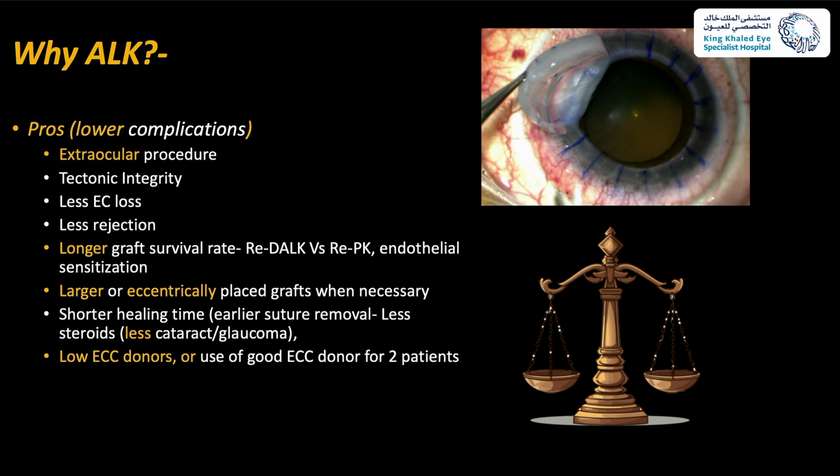Because we are not opening the DM or the Dua's layer, it's an outside-the-eye procedure, so there is less risk of infection, and also less risk of open-sky related complications such as suprachoroidal hemorrhage, lens prolapse and intraocular content prolapse.